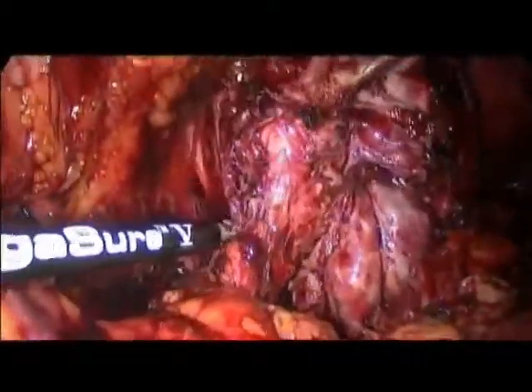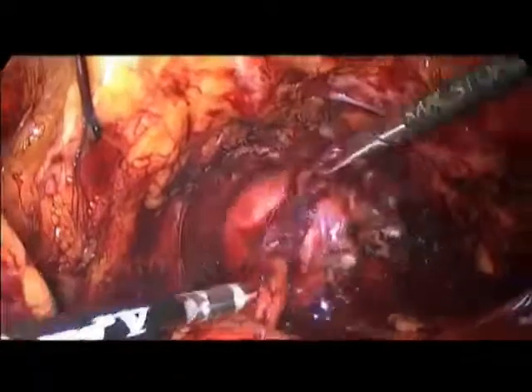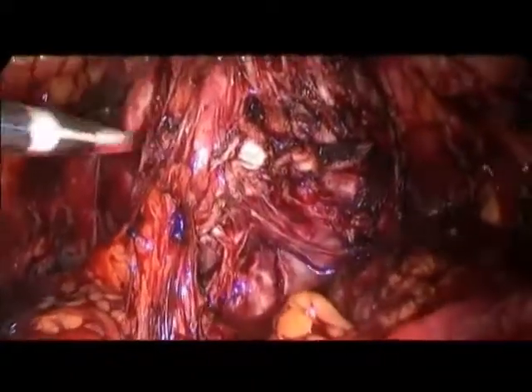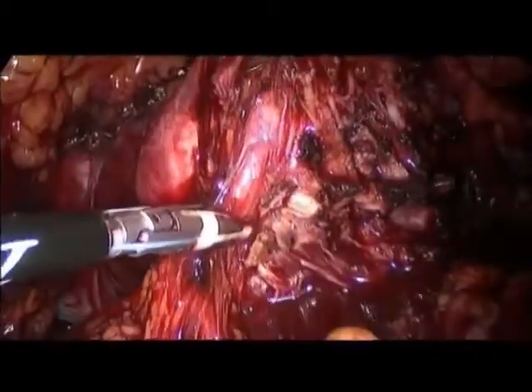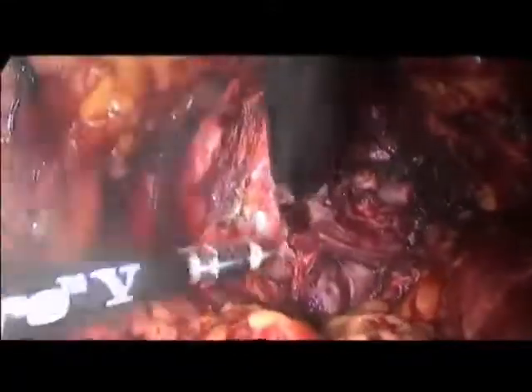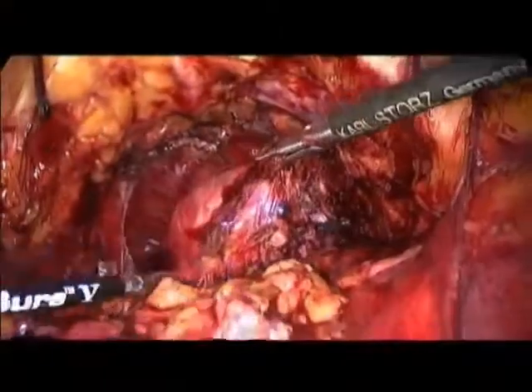We can start. Yeah. What is wrong? Overpressure. He's pushing. Everything okay? Yeah. Sorry. Just expose laterally a little more.